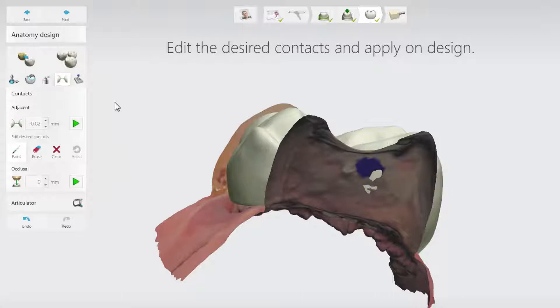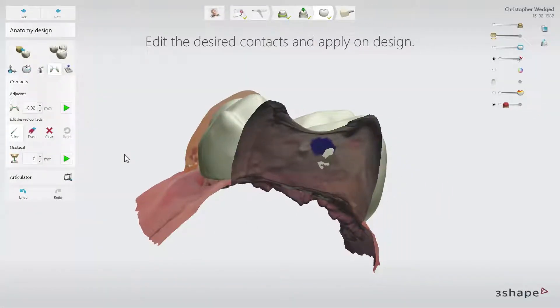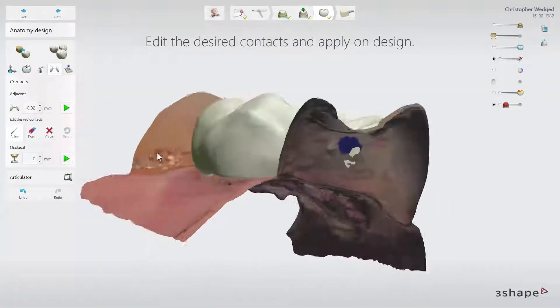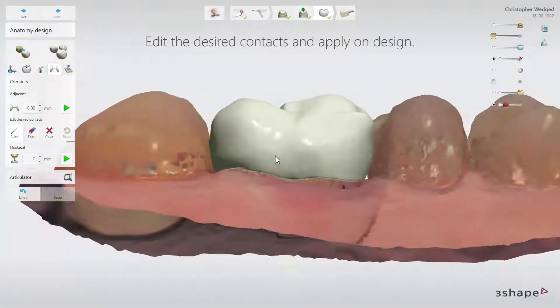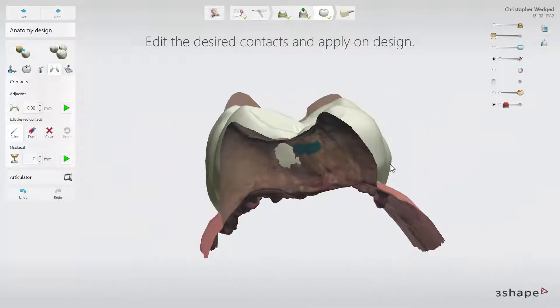When selecting the Contacts tool, the view is changed to show the restoration from the proximal side. At the same time the Centre View Clipping tool is enabled and will allow you to see through neighbouring teeth while working on contact points.